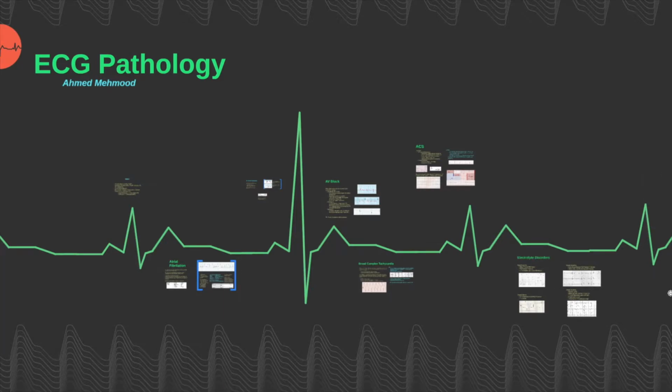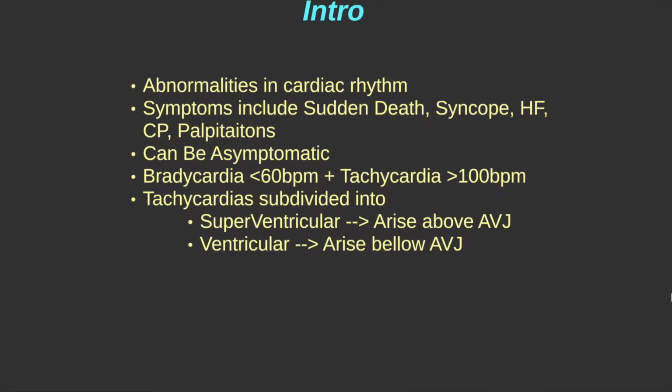Hey guys, it's Ahmed. I'm here to give you a follow-on to my ECG basics lecture, and I plan on including a lot more pathology in this particular one. So what I plan on covering is a lot of the arrhythmias, be that tachycardia or bradycardia, and I want to cover a bit about acute coronary syndromes and some of the stuff you'll see in electrolyte disturbances.